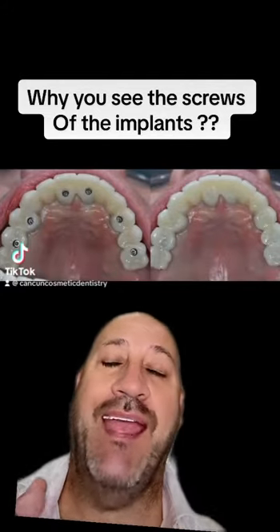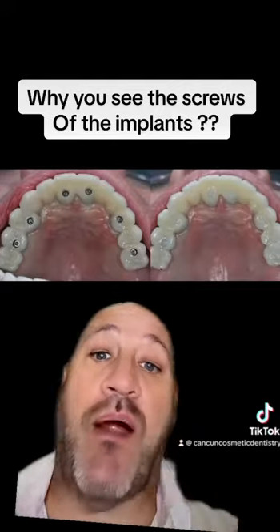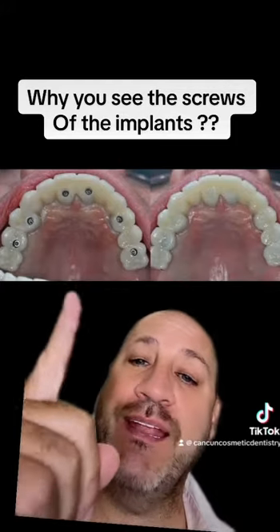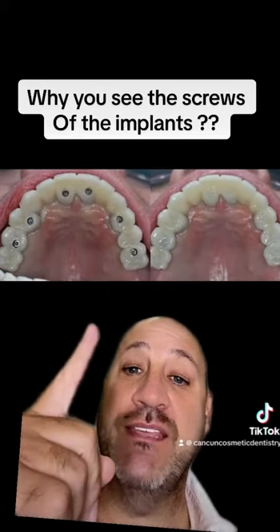Once you place the implants and they are already done and you have your bridge, your bar, and it's already in position, what are you going to see? You're going to see this. What you find here — that's what we see as dentists. Implantologists, they see that.